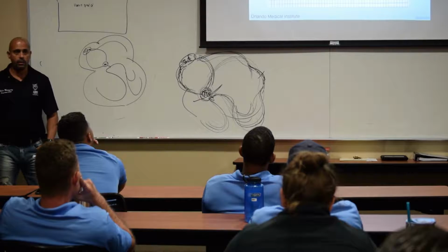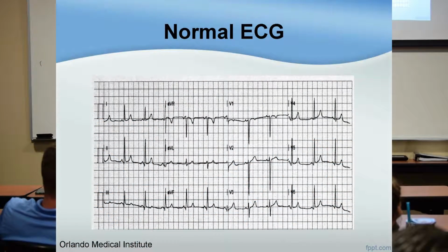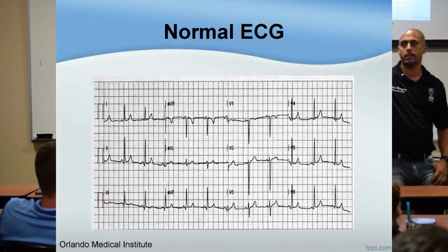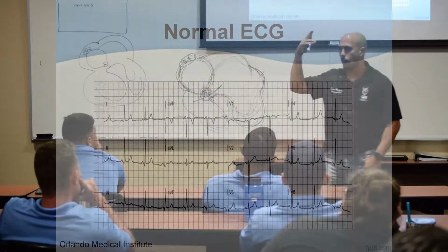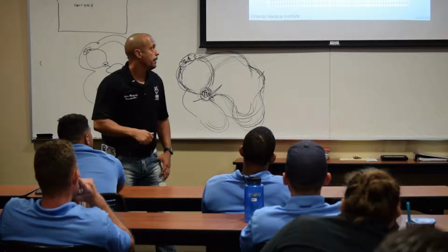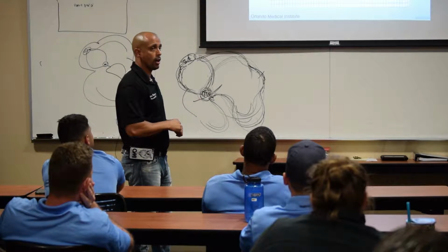So, normal ECG, 12 lead. All right? We look there. How we read a 12 lead, that's where I see a lot of people struggle. If you struggle with 12 lead, keep to the 5 basics. I like to say Felix's 5 basic rules of an ECG. Go to lead 1, the first one up in the corner. I want to look first, and I want to say, what's my rate and rhythm?